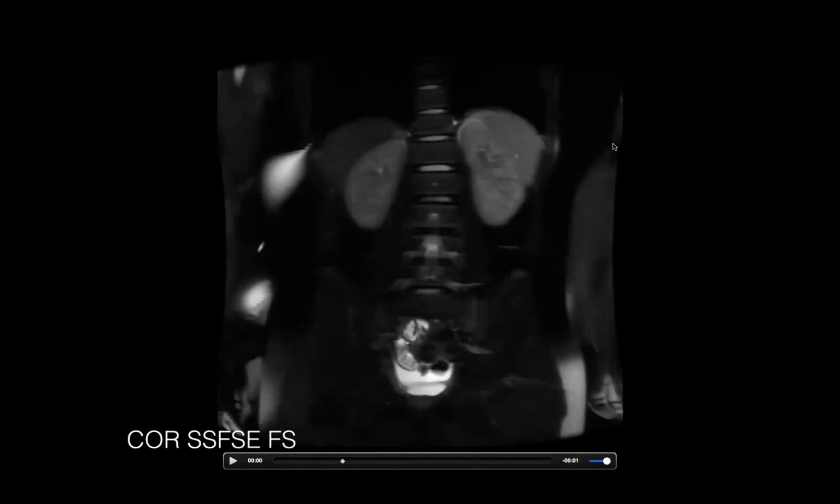So part of this is that they're distorted from being so far out from isocenter of the magnet, right? And so there's a correction algorithm on the scanners to deal with the gradient nonlinearity that far out. For instance, you almost see it here. Do you see how the edge of the image is curved? We don't actually have a rectangular image. That's from this correction algorithm, but it only works so well, so here you can see that it's not fully corrected.